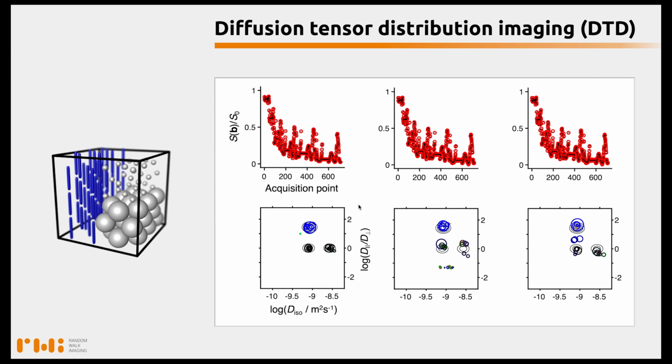This DTD algorithm actually acknowledges it and embraces it, and can be simply repeated in order to find different solutions that all fit the diffusion signal to the same or to comparable extents. A more refined solution of our problem can then be defined, for instance, as the average of these different solutions. And a sense of uncertainty can be gained by computing, for example, variances across these different solutions.